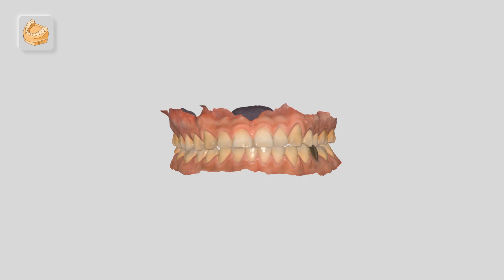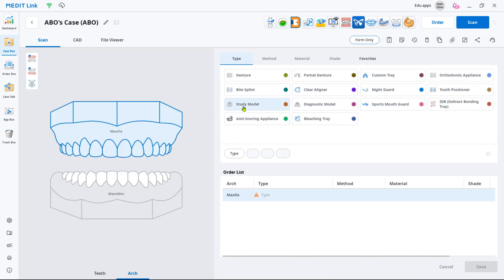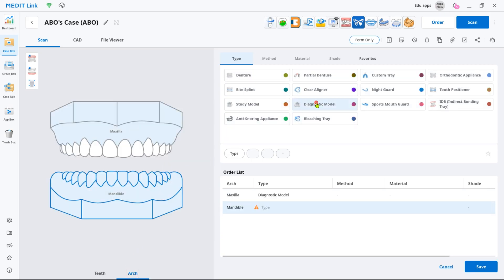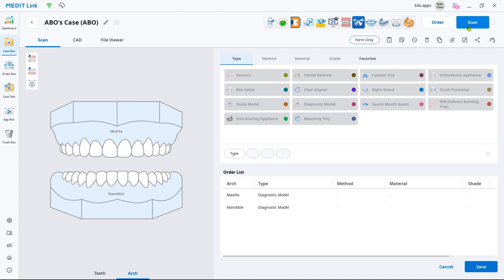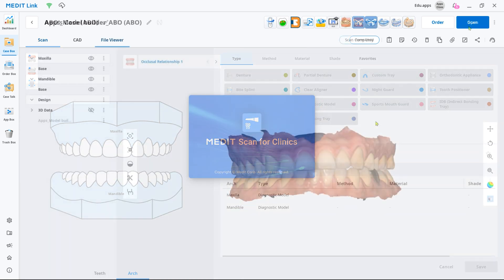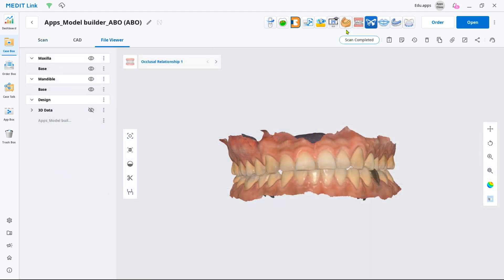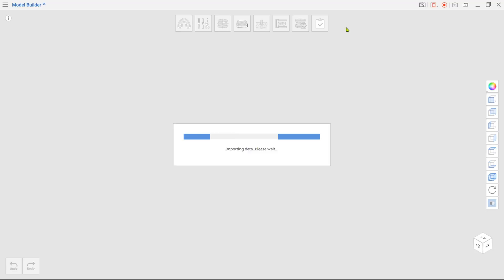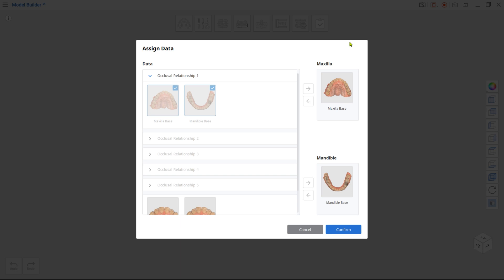You will need the scan data to work in the app. Create a new case, select Diagnostic Model as Product Type in the form, and then scan both arches. After scanning, open Model Builder by clicking the app icon at the top. Your scan data will be automatically assigned.